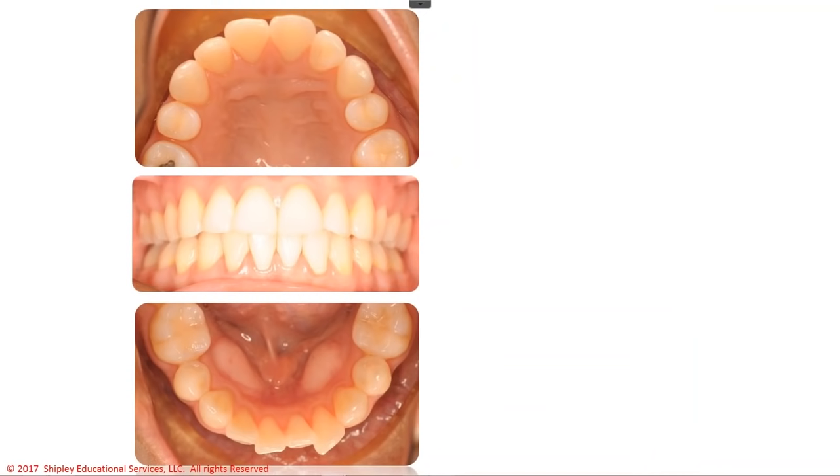So this one's a little bit different. On the bottom we got some lower anterior crowding, so we're going to do MOPS lower 2 to 2. On the top we have some previous upper second bicuspid extraction sites that open back up. So on the top we're going to do MOPS mesial to the 6s, mesial to the 7s, and distal to the 7s to close that relapse space.